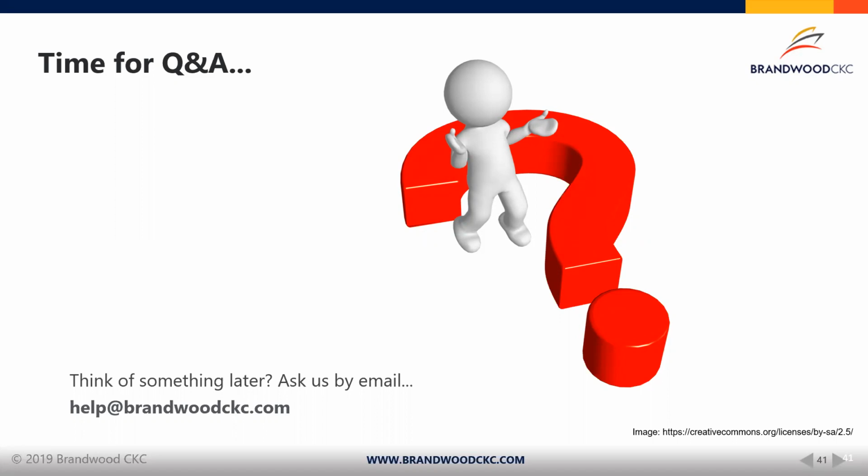Okay, we've got another question. How much does it cost for an organization with less than 50 employees to obtain ISO 13485? This is a bit of a difficult question to answer because it will depend on the quote you obtain from the certification agency. Typically, first of all, you need to consider the cost of development of your quality management system. This is a process that takes time and resources, and it has to be implemented prior to envisaging a certification.